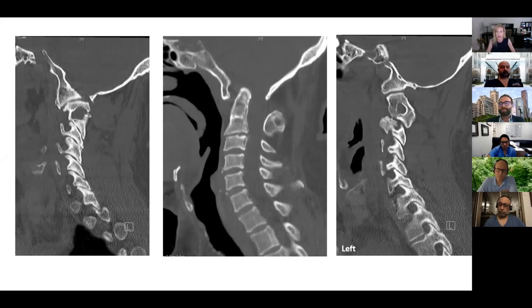Absolutely beautiful. Think about it like a central cord syndrome, right? A patient with pre-existing stenosis in the subaxial spine falling down, having upper more than lower extremity weakness, like central cord syndrome. This is central cord syndrome of the upper cervical spine, which equals what we call cruciate paralysis. And pre-existing CVJ abnormalities: atlas assimilation, Klippel-Feil, C2 fused to C3, very deformed anatomy here. He has a little bit of platybasia, I'll show you a different slide, and maybe a little element of cranial settling. So this was pre-existing, he fell down, he became symptomatic, obviously with an increased ADI.